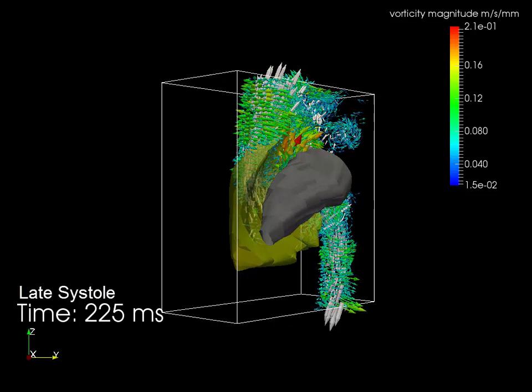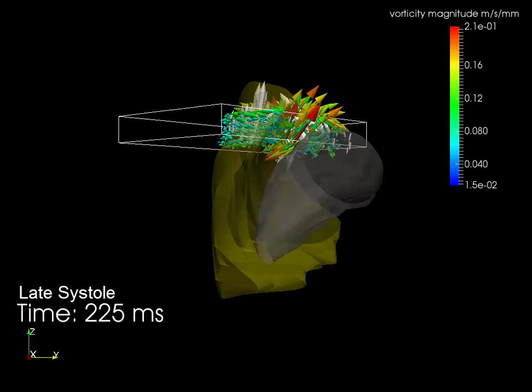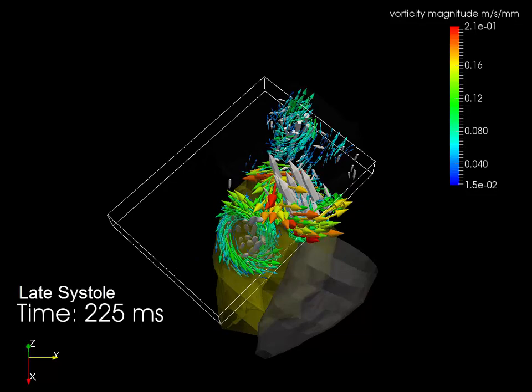Now we are going to look at vorticity, rotation of each element of fluid. Let's look at just the vorticity in the main vessels at the top of the heart.